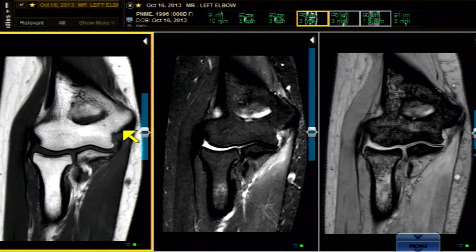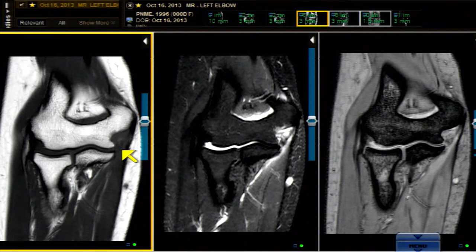At first glance, the anterior bundle of the UCL looks pretty good. It has a somewhat straight, slightly arcuate course where it inserts at the sublime tubercle of the ulna, and a broad base up higher. Remember, we're only on one cut, so we have to sweep all the way from front to back for the anterior band of the UCL.